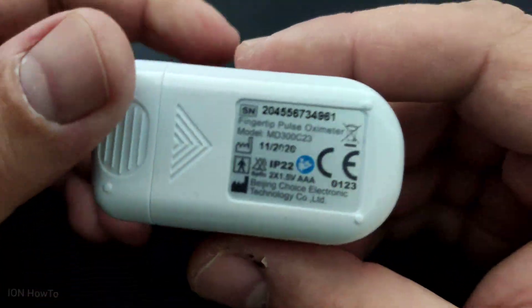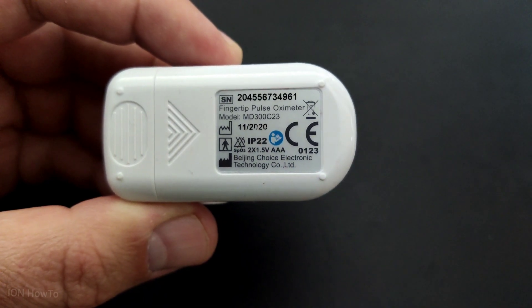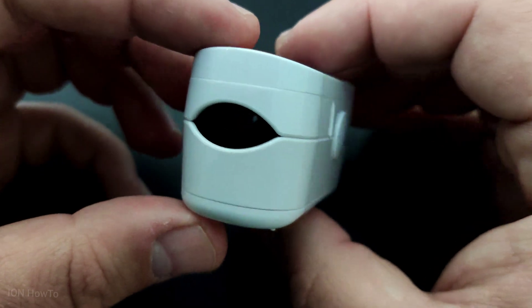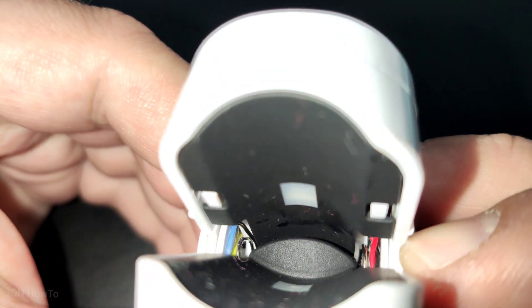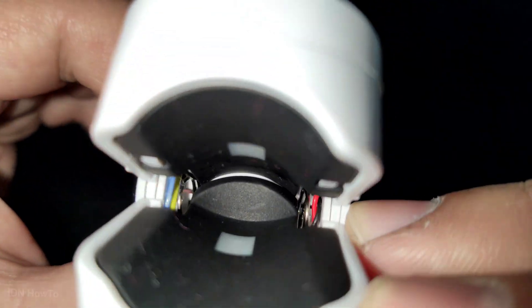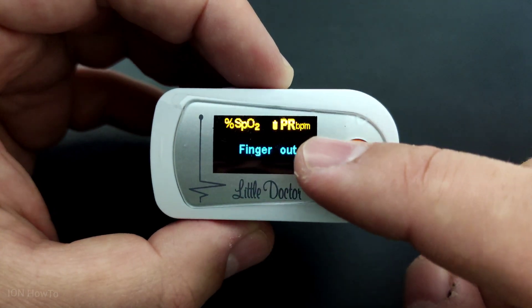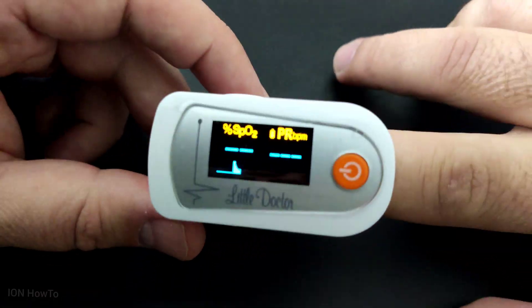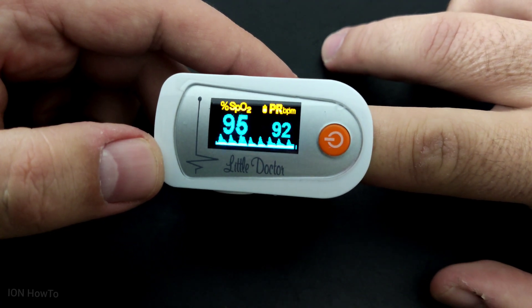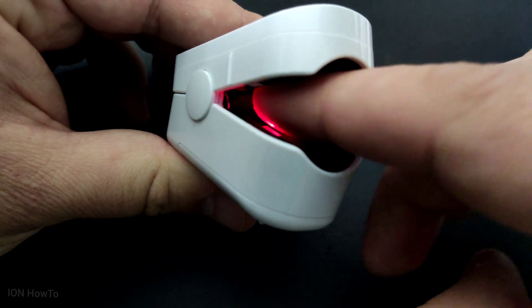This is an oximeter. It measures the oxygen level in the blood and the pulse from one finger only. This is the actual sensor — it uses light to interpret the color of the finger. You put your finger into this oximeter and it's going to show you the oxygen concentration in your blood.